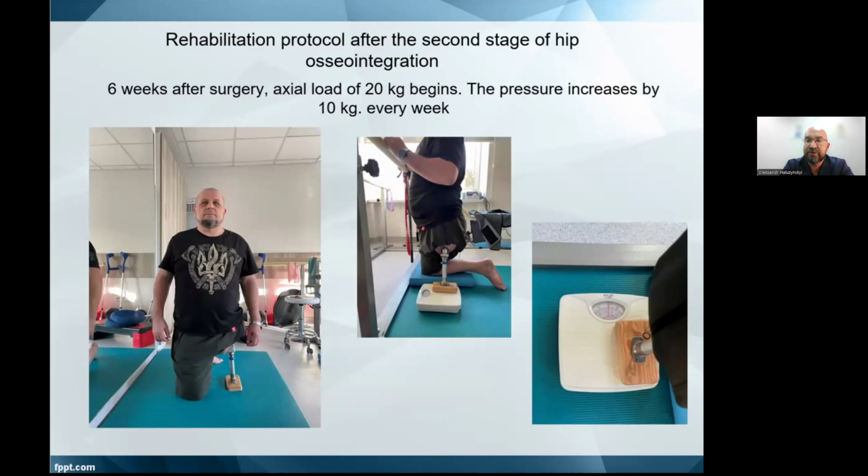Solving surgical issues is not everything. Osseointegrative prosthetics is a team game of surgeons, prosthetists, psychologists, and rehabilitation specialists. We come to the conclusion that osseointegration should be done by specialized centers. Rehabilitation is an important stage on which the final result might depend. I would like to briefly talk about rehabilitation protocols.